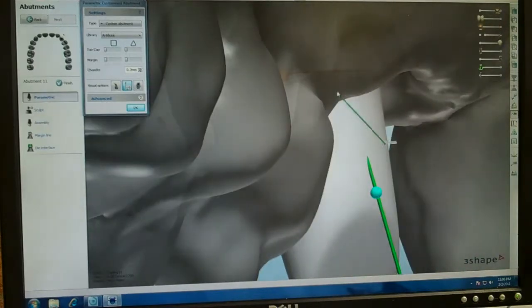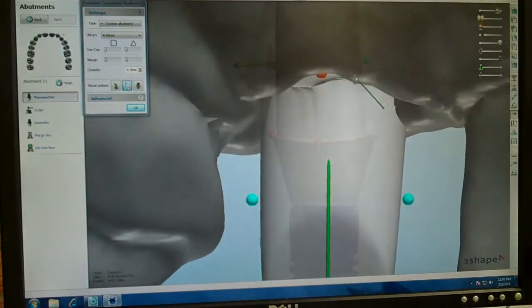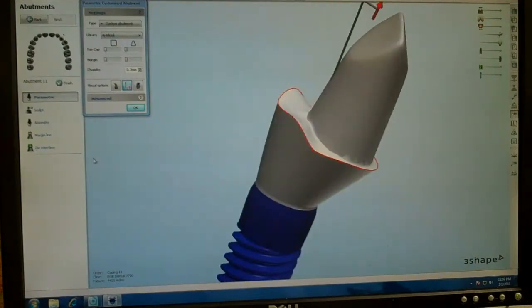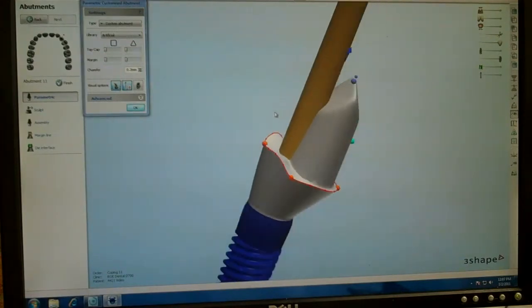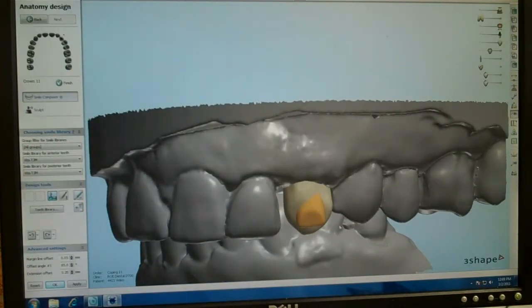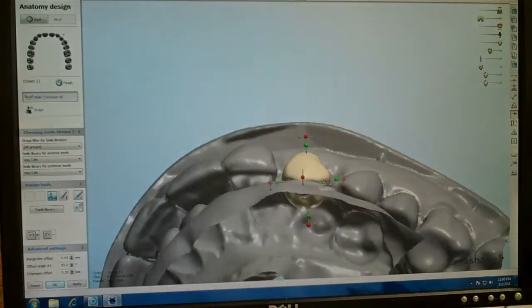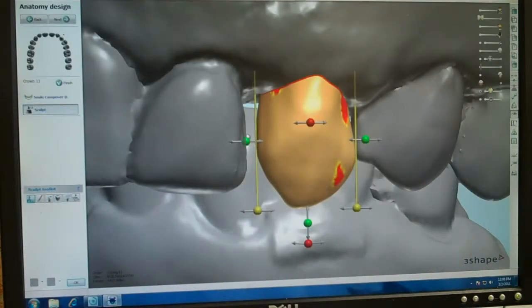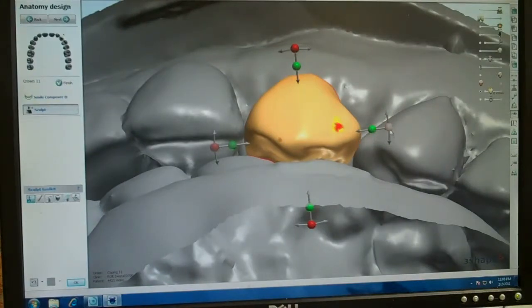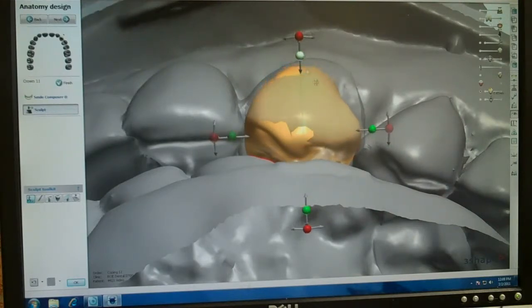On the lingual we'll follow the gum line. We've got a nice shoulder around the abutment. This shows the trajectory of the screw. The software gives us a tooth to set in place and we just rough it in here and make adjustments from there — then we make our proximal contacts. We can bring in our wax-up again to make sure we stay within the confines of that.